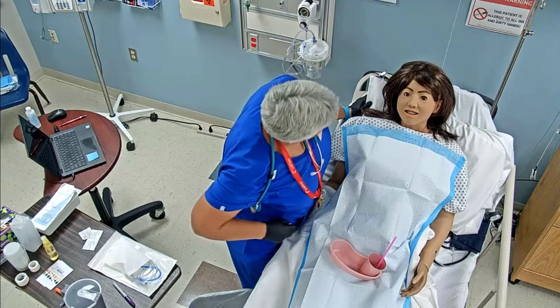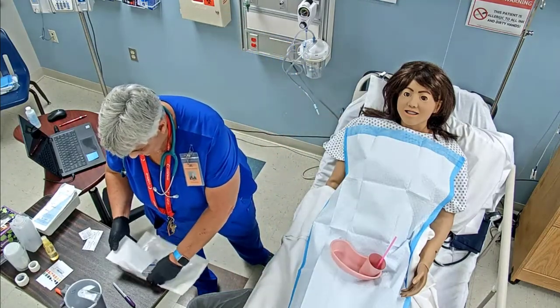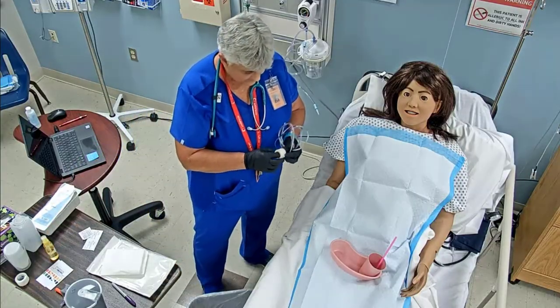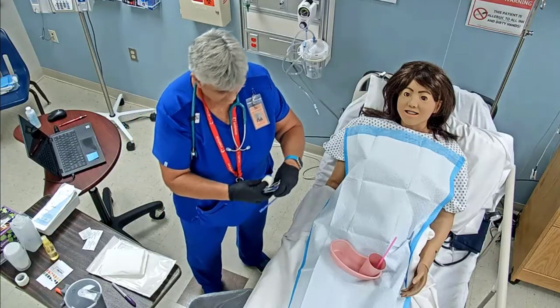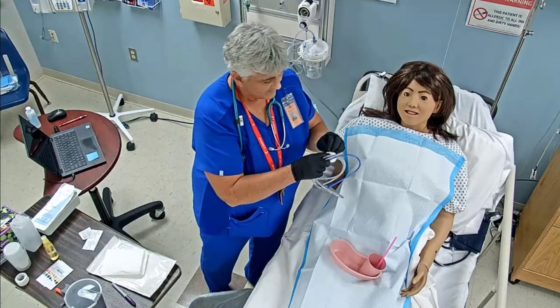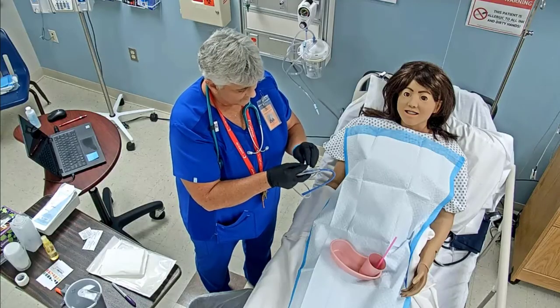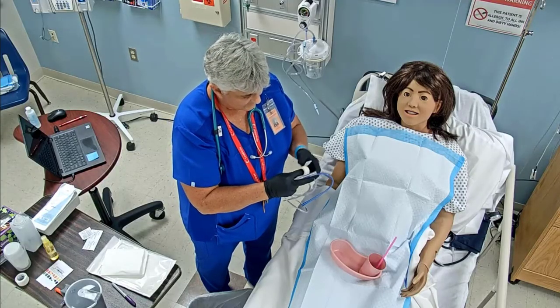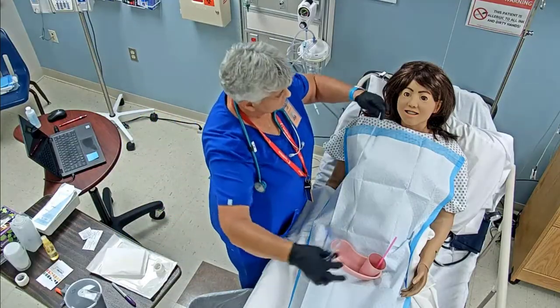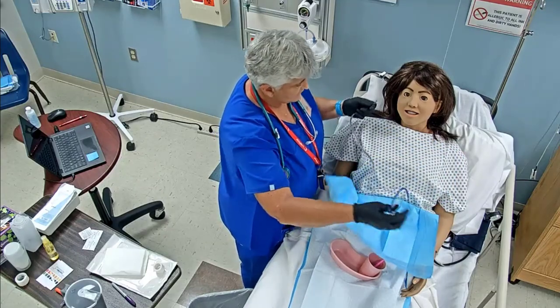And so once we've done that, we're going to go ahead and get our NG tube. I've got my tape right here. Let me get it started. Okay. And I'm going to take my tube. I'm going to take this down for just a second so I can find your xiphoid process.